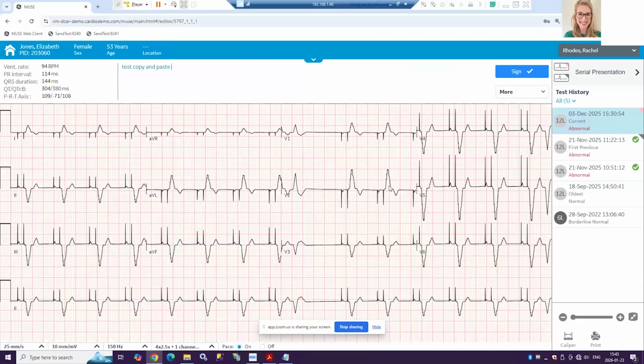Next question may be a little bit difficult to answer straight up, but great demonstration. Thanks, Rachel. Could you show us how to export ECGs in different formats, for example, PDF, XML? Is it possible to export ECGs anonymously or under a custom study ID, for example, for research purposes? So the answer to all of that is yes, but it is quite a lengthy demonstration. So I don't know where the question has come from. If it's from UK and Ireland, please contact me directly and I can run a short session with you.